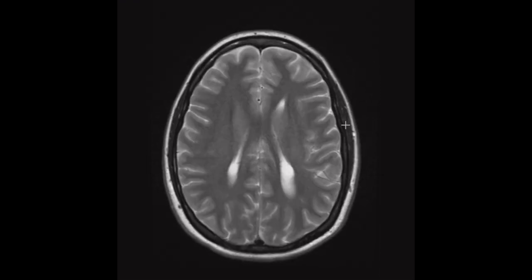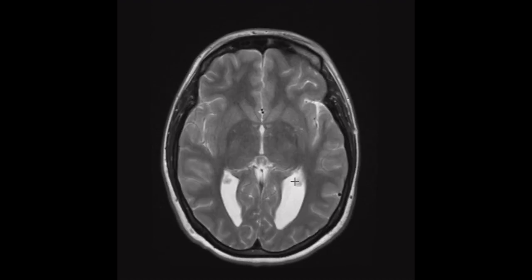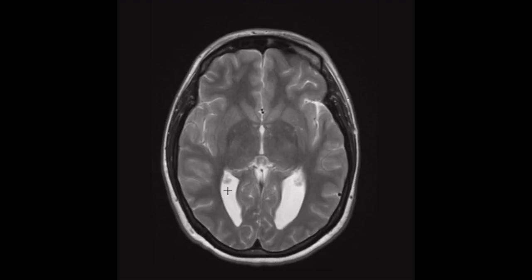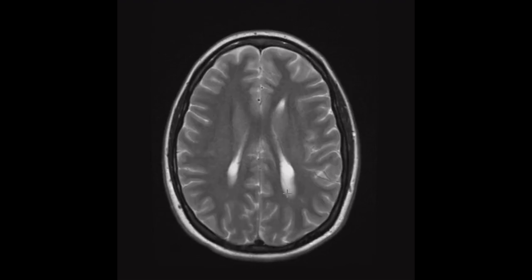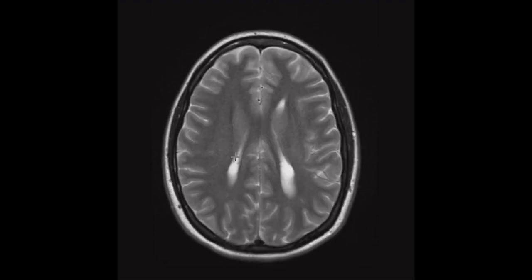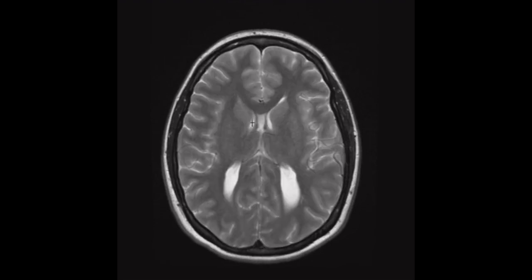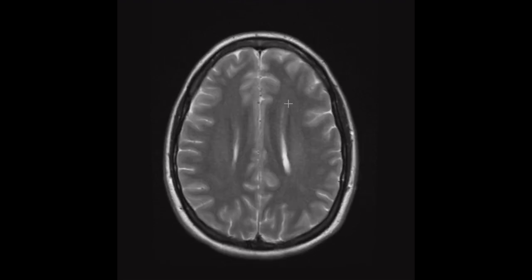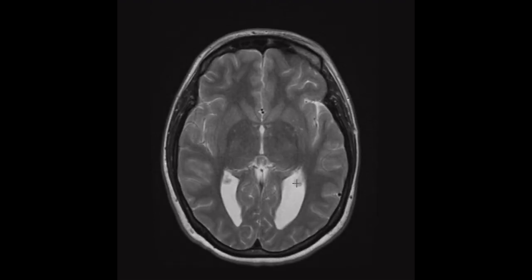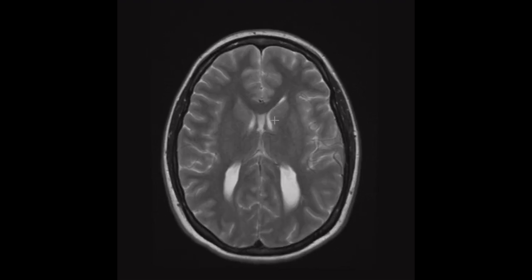On this view, we see that the left and right halves of the brain are symmetric, but the occipital horn and trigone of the left and right lateral ventricles are too big — so too much fluid here and here. We call this colpocephaly. The ventricles are relatively parallel; normally they come together and touch at the midline, but the left and right lateral ventricles don't touch. They're more widely separated with a parallel appearance and distention in the back called colpocephaly. This makes us wonder about maldevelopment of the midline structures causing the abnormal appearance of the ventricles.